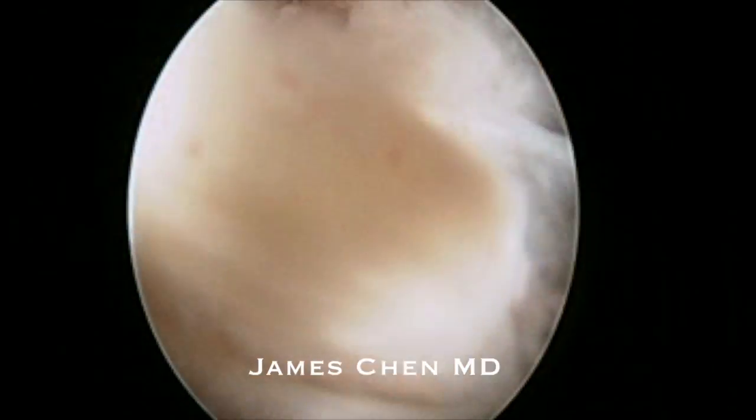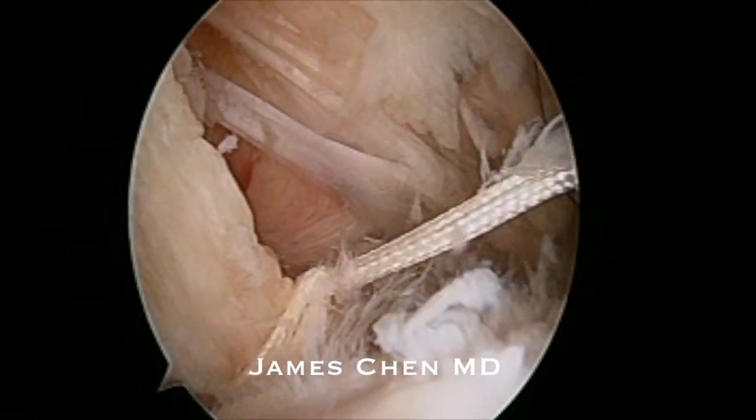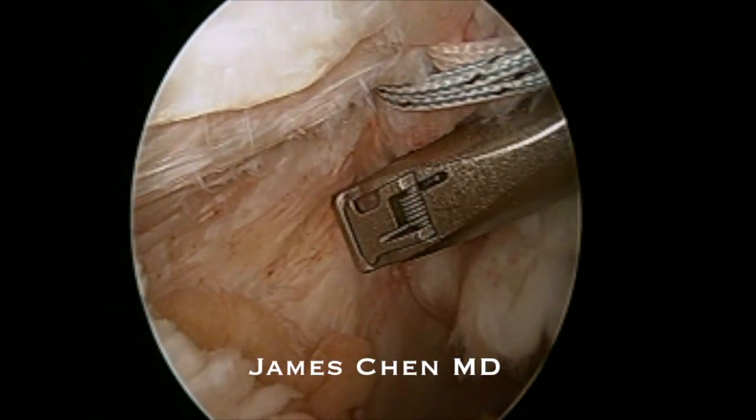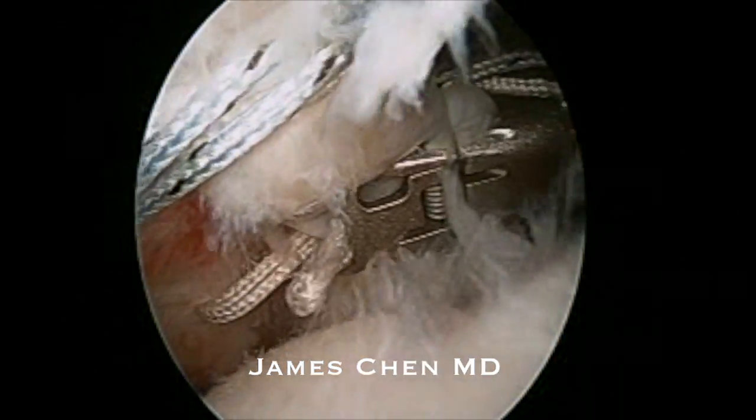I have a portal anteriorly and anterior laterally. I inserted the scorpion fast pass from the anterior lateral portal. I put in one racking hitch suture and then a second. Here I am more distally putting a third suture in.